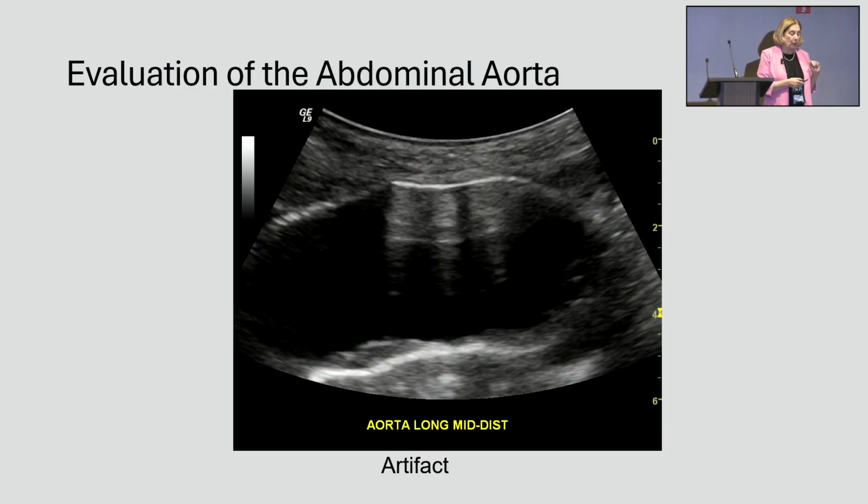I have been the one who's made a mistake at times. Other people have too. So another thing to do is look and know what the last measurement was, but measure it yourself and don't try to just match it. And I'll show you a really good case of that in a moment.